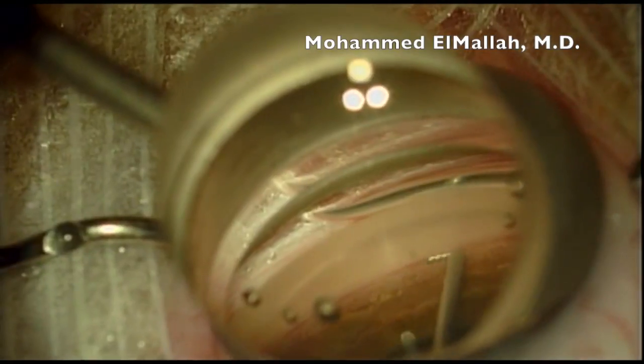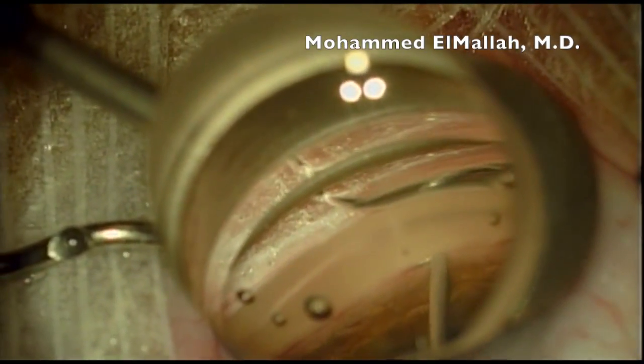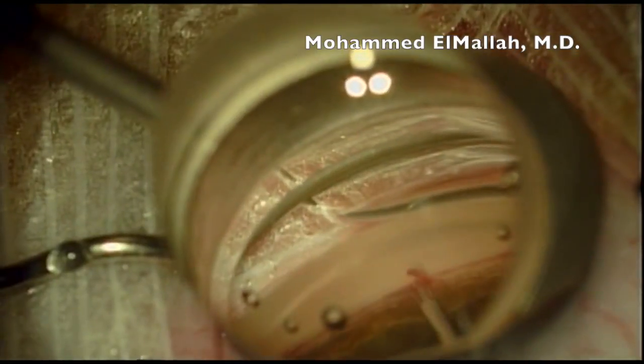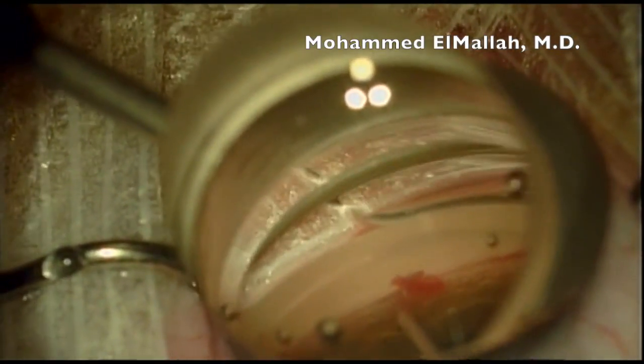During implantation, you are puncturing the inner wall of Schlemm's canal, or the trabecular meshwork, and threading the device into Schlemm's canal. The snorkel remains as a bypass for aqueous to travel from the anterior chamber into Schlemm's canal.